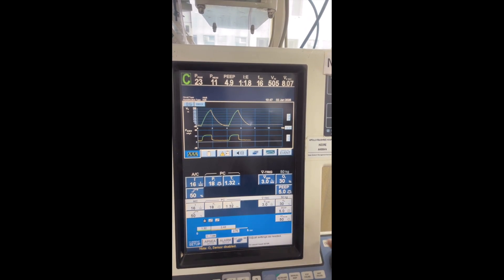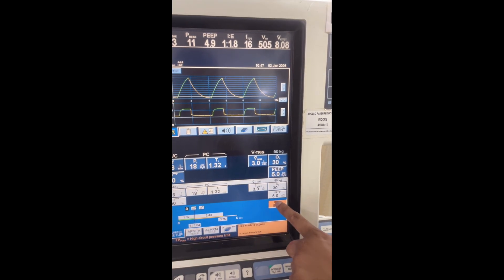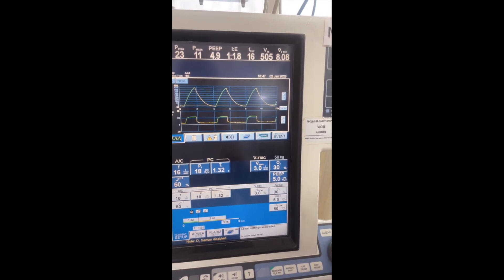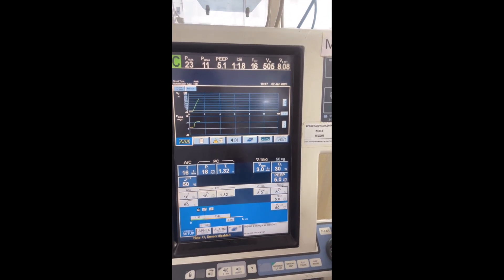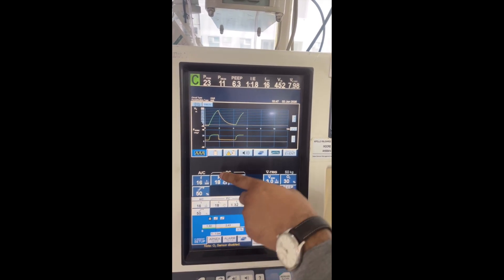And you set the I:E ratio. Based on this, now on this you set the maximum peak pressure. This peak pressure we have set so that it cannot go beyond that.